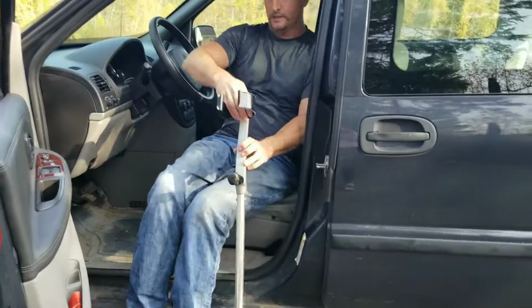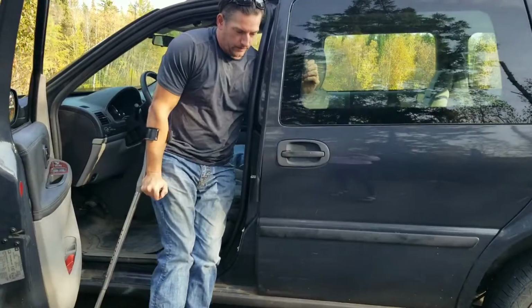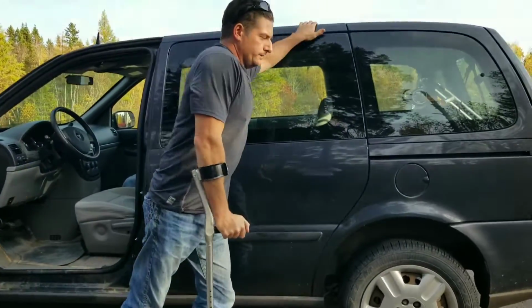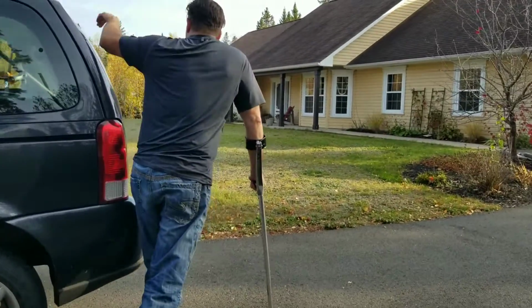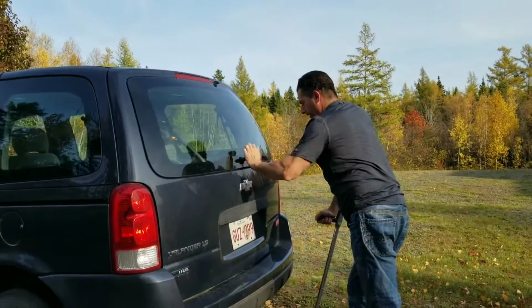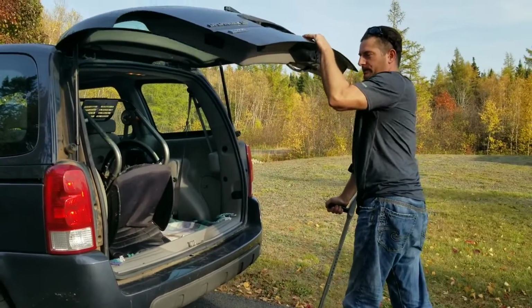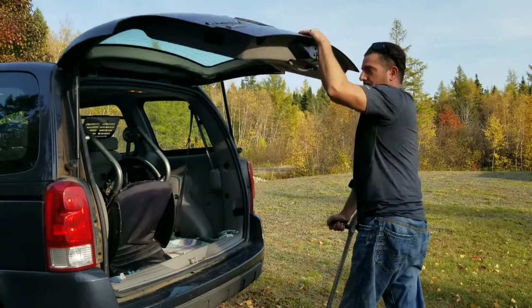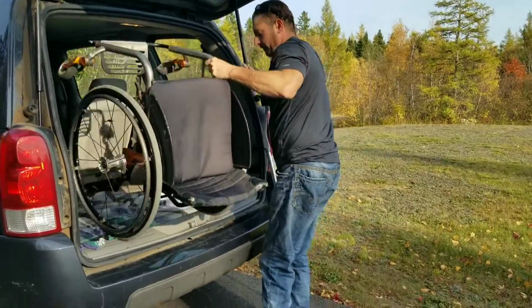To get out, grab my crutch, have it in my right hand, and all I do is just pop myself up like this. Walk back around. Now it's a little tricky here with the hatch. I just open it that way. Sometimes you gotta really take it slow, because if I come up too fast, it'll knock you back and you might lose your balance. So it just depends on your vehicle, how it reacts. Then I just take it, pop it out like this.